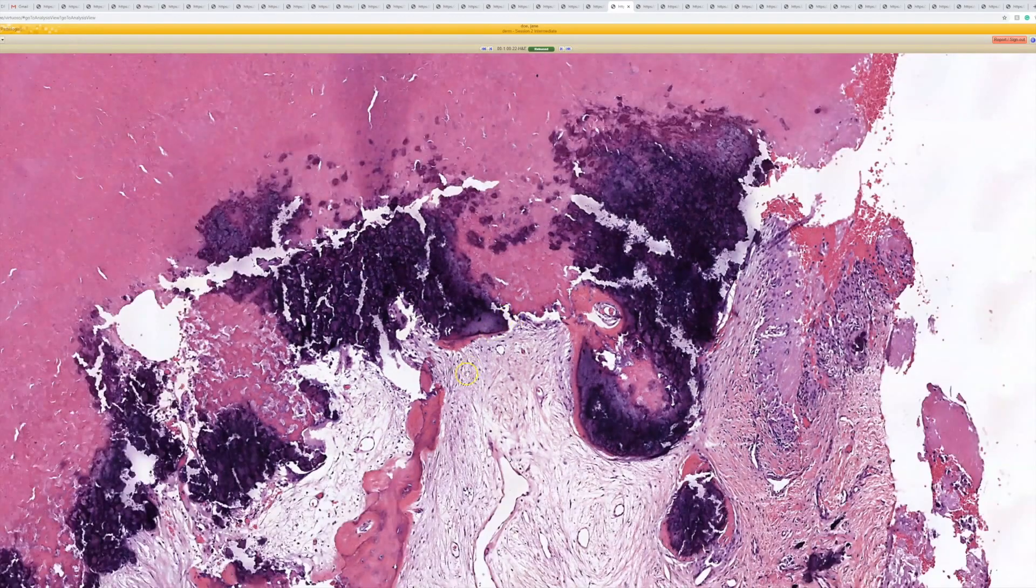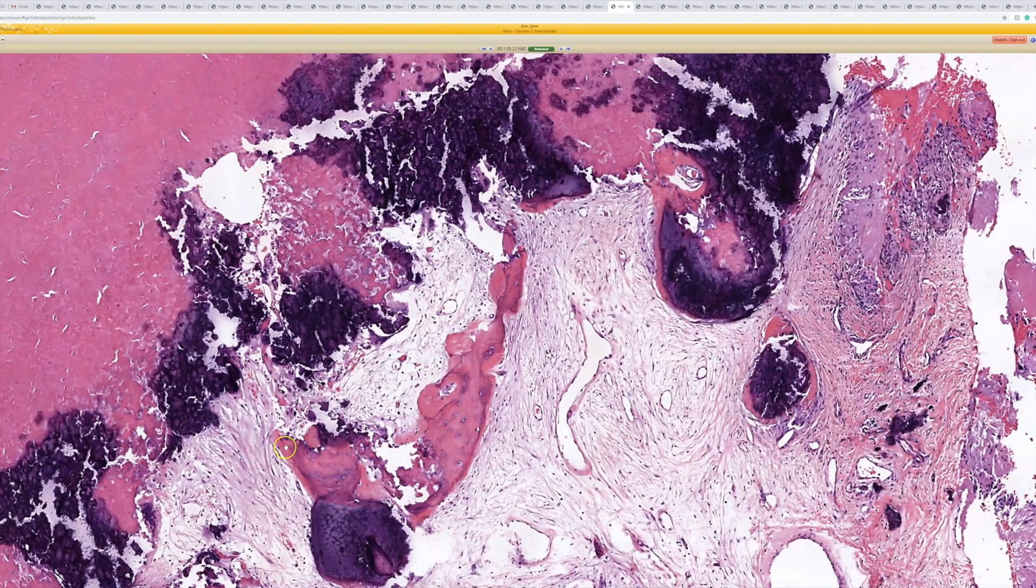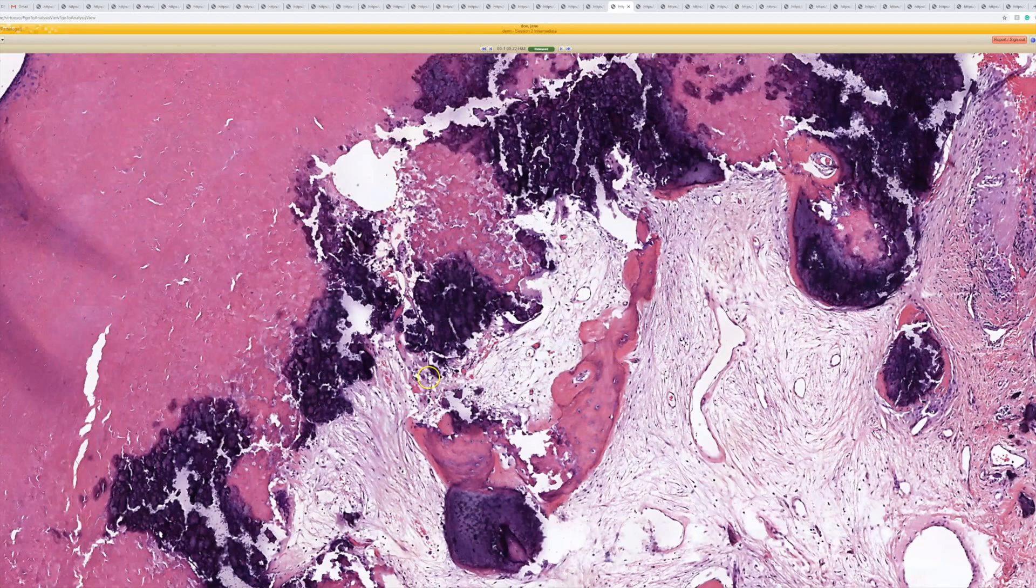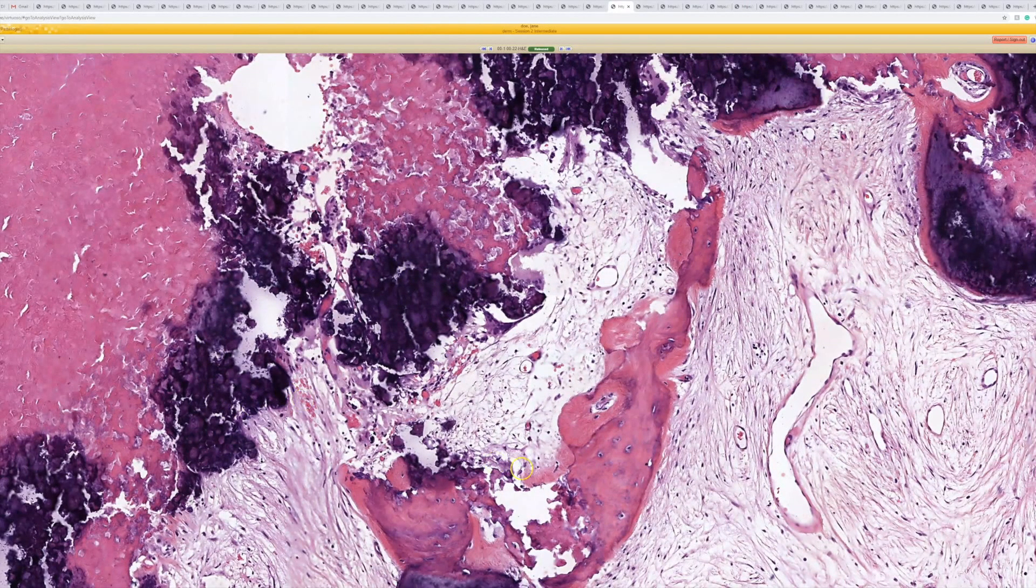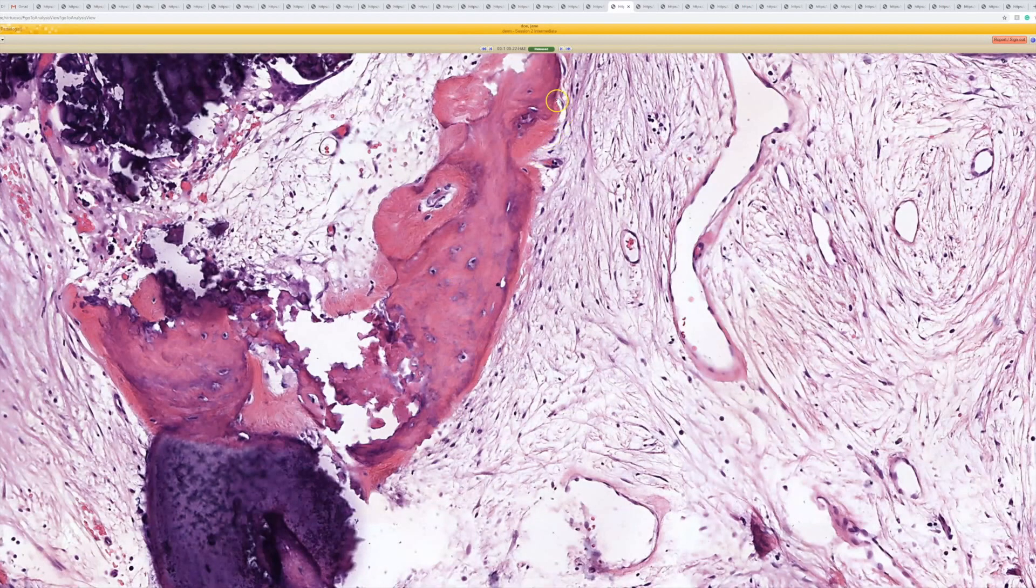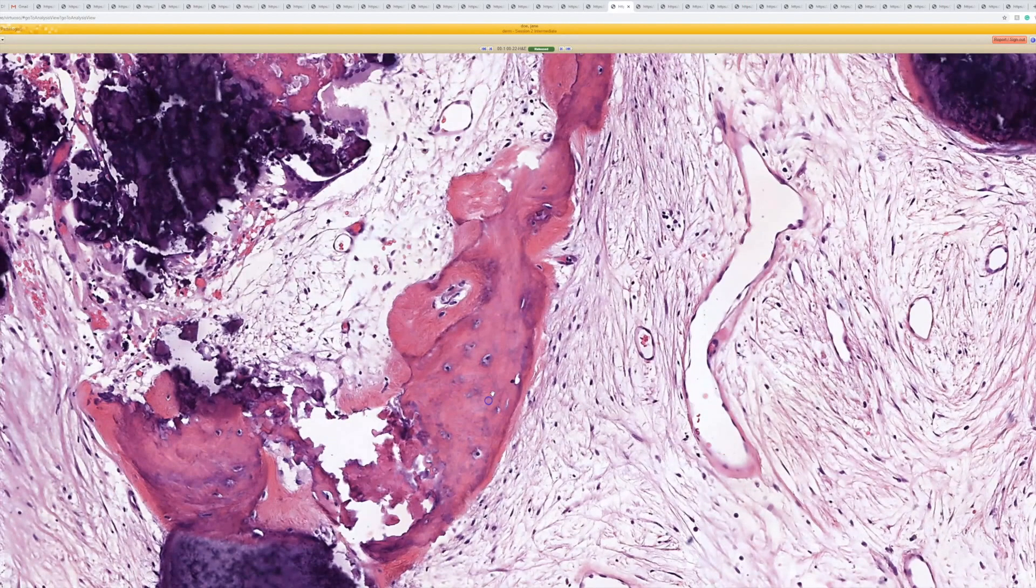And this one has what going on in the middle? It's like some ossification. Yeah, you've got calcification here, the purple stuff, which you often see in pilar cysts. And occasionally you can actually see metaplastic bone formation, which is what we have here.